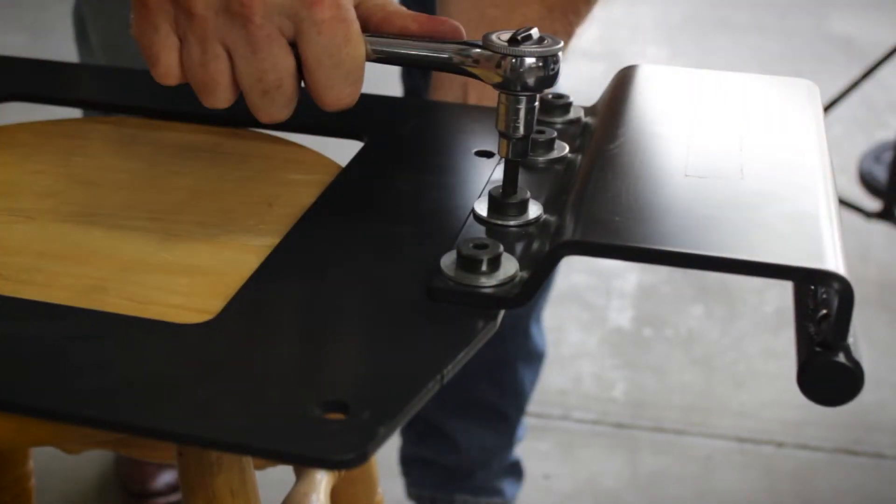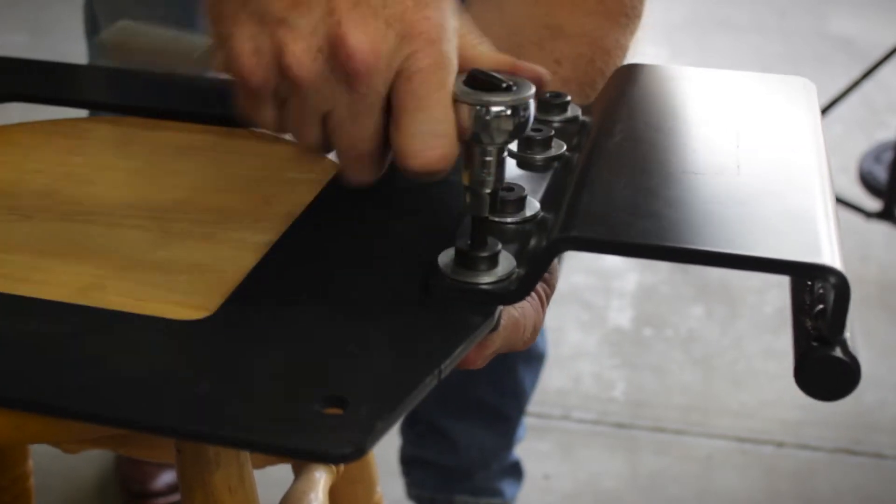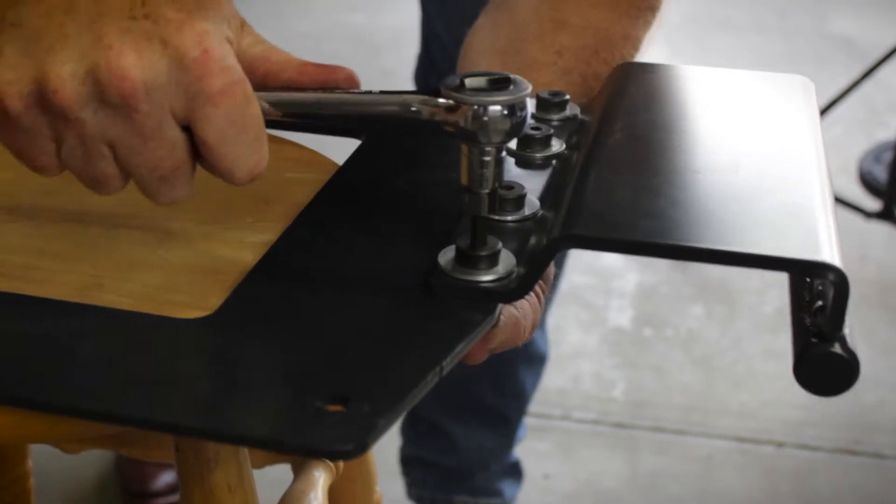Loosely attach all four bolts before completely tightening down. With all four bolts attaching the side bracket to the main frame bracket, the brackets are now ready to be attached to the power wheelchair.